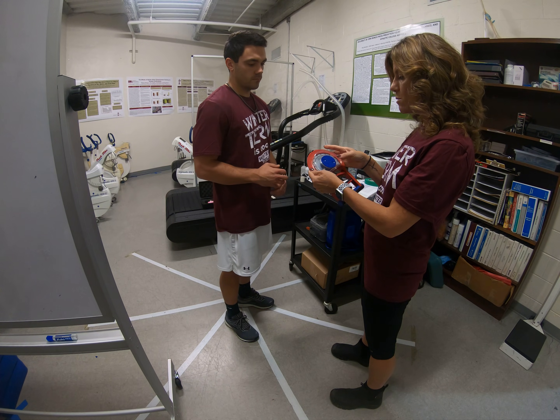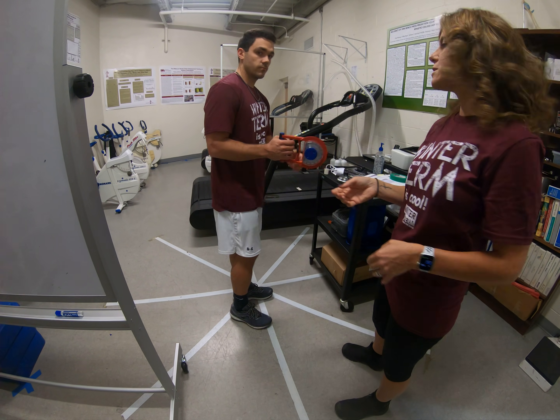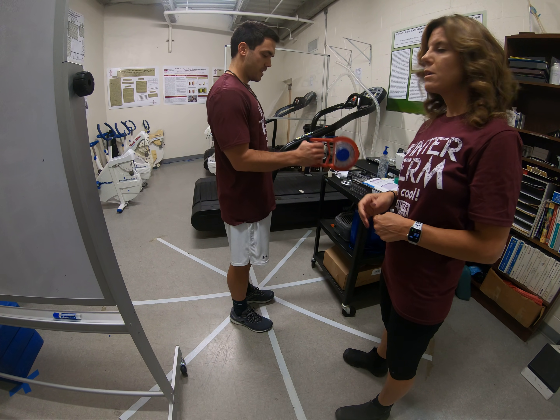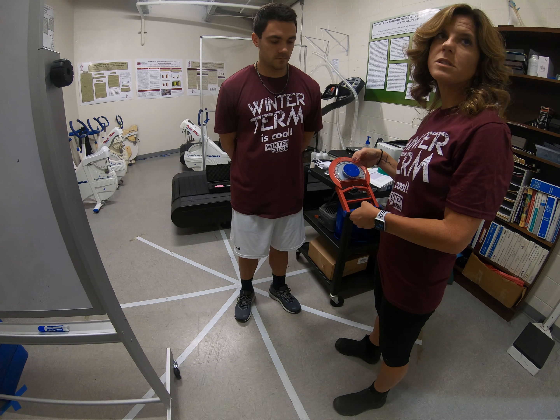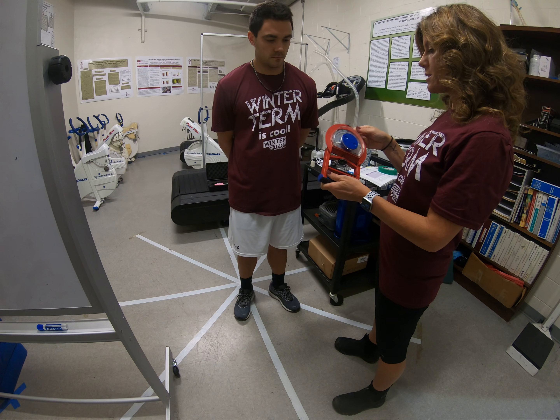Set it to zero and they will do it again with the first hand that they used, again squeezing without holding their breath. Calculate that number — 61 kilograms we see here — and again calibrate it to zero.